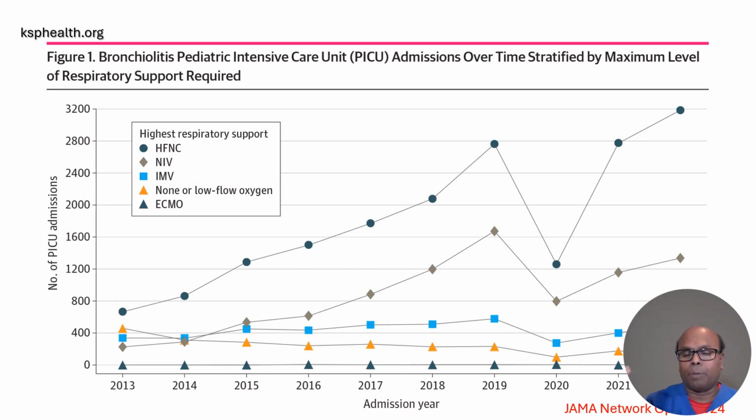We didn't have that much usage, and there was also a scare of using high flow nasal cannula because it can disseminate virus. Apart from that particular year, the usage of high flow nasal cannula continued to go up, while invasive ventilation remained static.